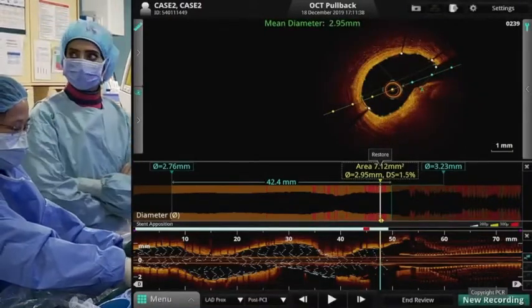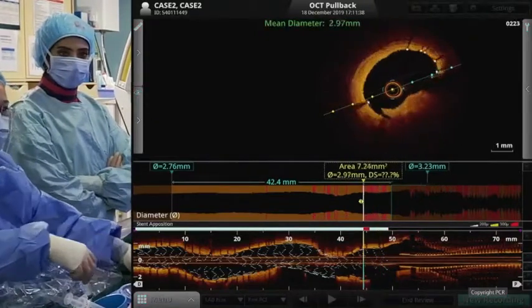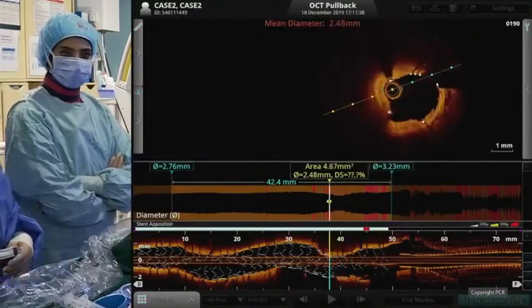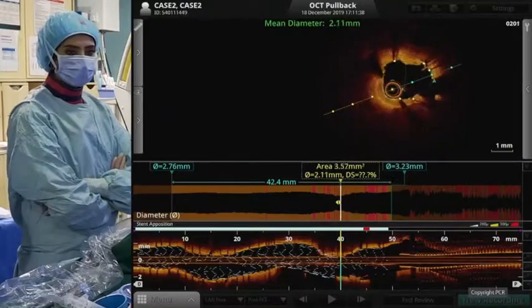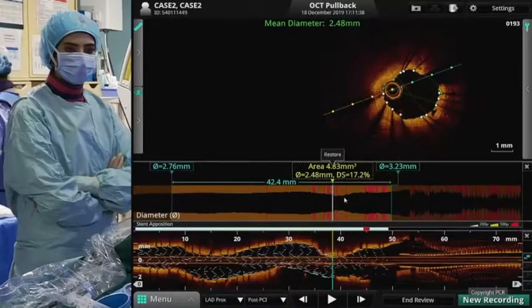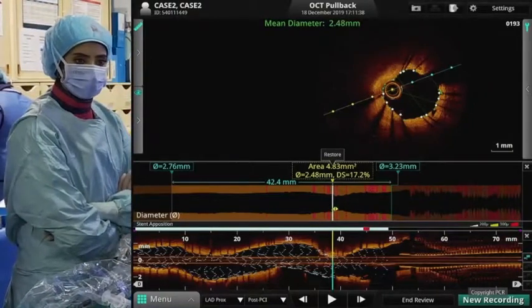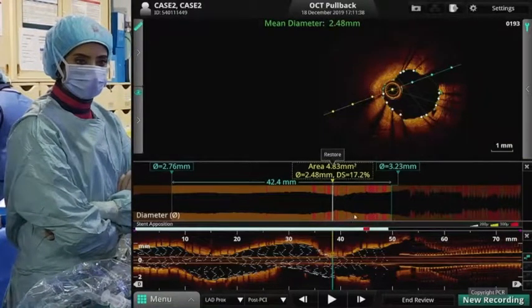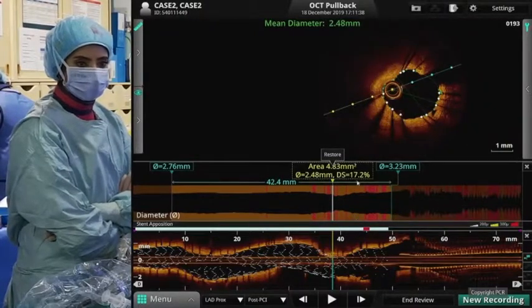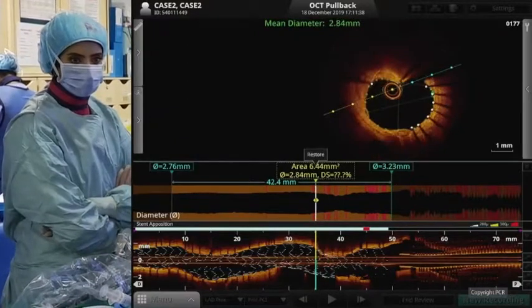Hussam, go back to where it is the 35. Go to 35. Stop. Go back. This is the point that Khafir is making. We need maybe to go back to where the indication of the machine is wrong. So to the red marker. Yes. So this is where it says 3.0 because this is for 4.3.